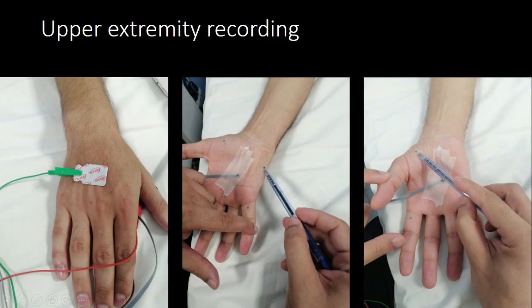Because you're going to calculate the distance, which is another important piece. If you mix up even 0.5 centimeter, it's going to make a big difference. So be careful when you are calculating your distance. So put the marks. That's what I tend to do, but everyone is a little bit different.